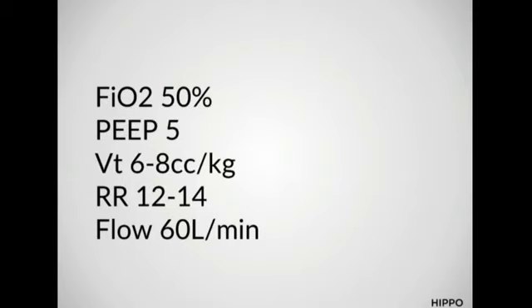Now, I understand how to adjust all of those except the flow. Does that make a huge difference? Because it seems to me like if I'm increasing my flow, then I'm just getting that volume faster. Right. It depends which mode you've started them with, but often starting around 60 is reasonable, and we usually titrate this in increments of 10.